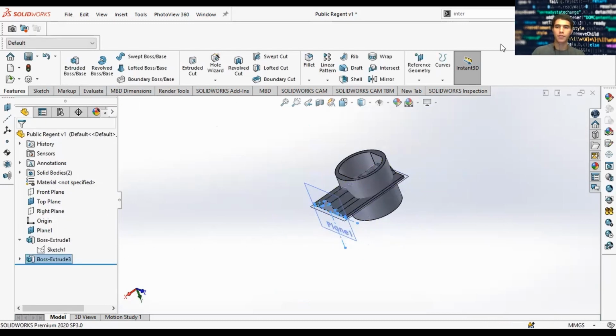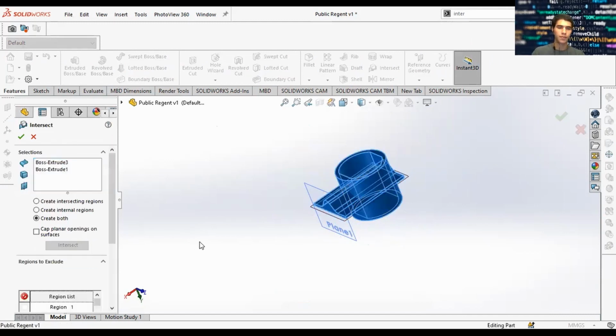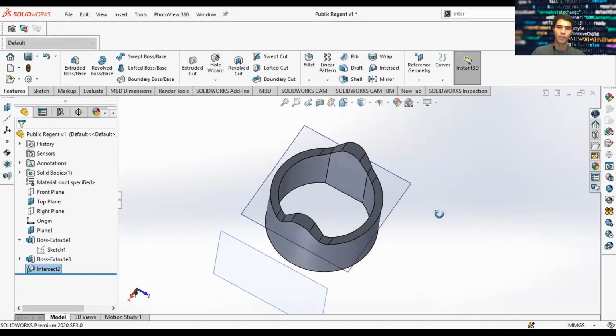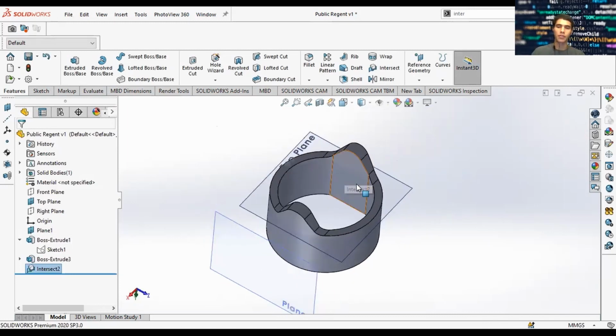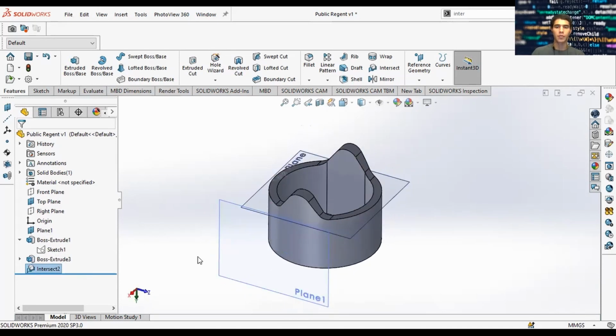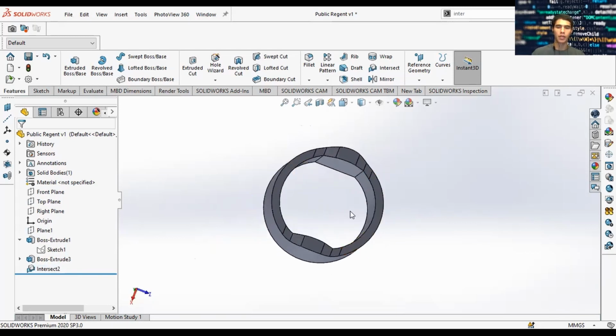We'll repeat intersect. Let's get our new intersection. There we go. So this is what it's supposed to look like once you're done. This will be this flat face where the leaflets will be mounted. And that's the shape. Cool. So what's next? You want to now mount those leaflets. And to mount those leaflets, let's hide this plane. You want to have a sketch, and we'll do a sketch on a plane here between the two leaflets, between these two flat faces.